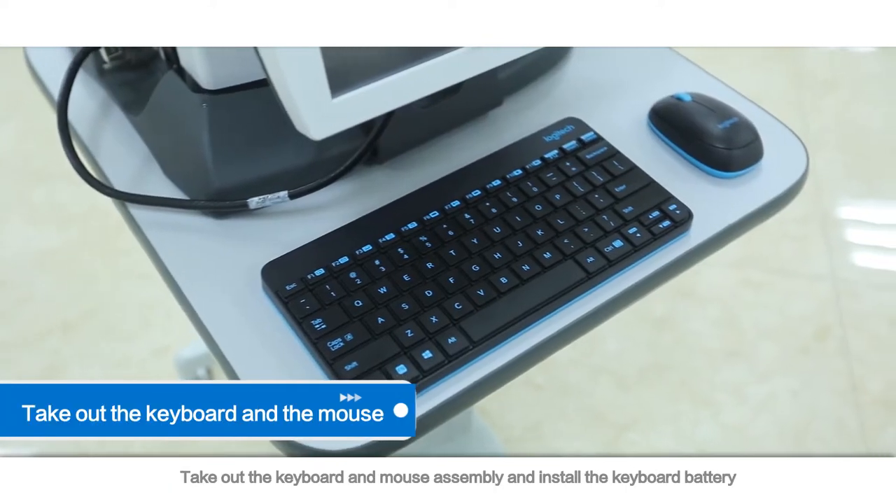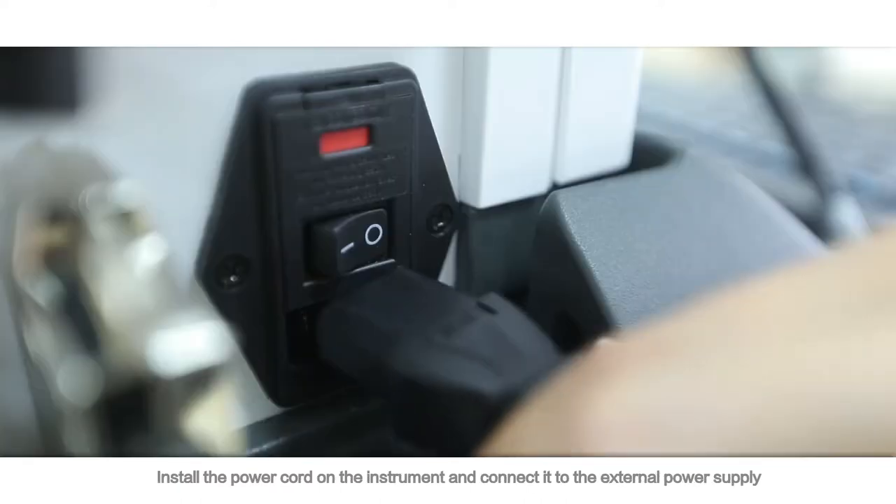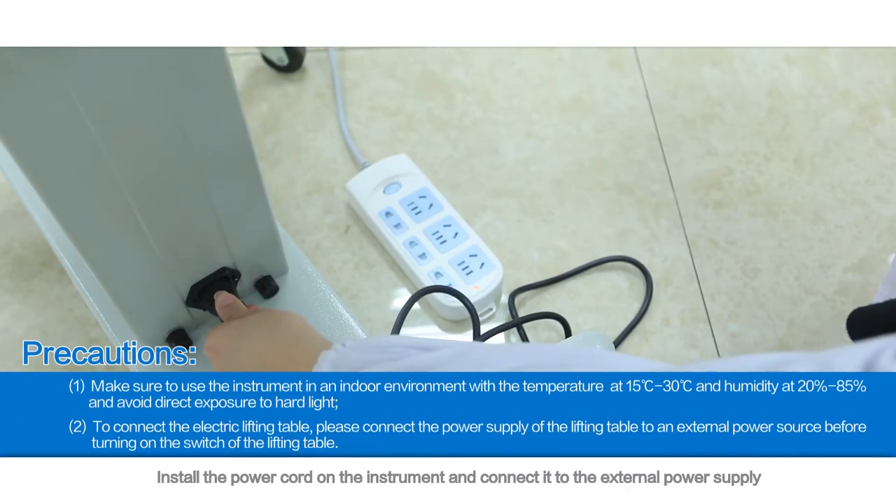Take out the keyboard and mouse assembly and install the keyboard battery. Install the power cord on the instrument and connect it to the external power supply.